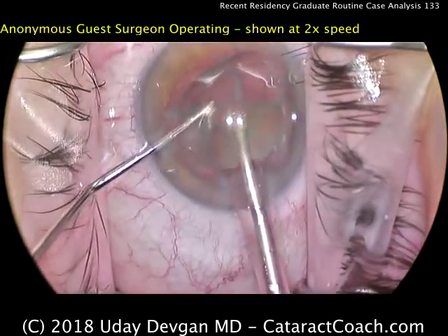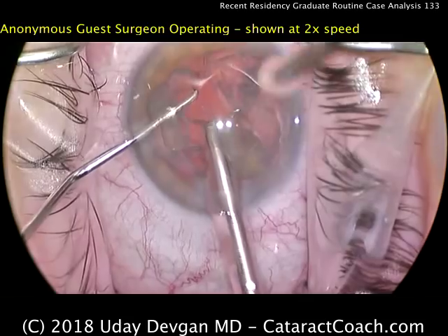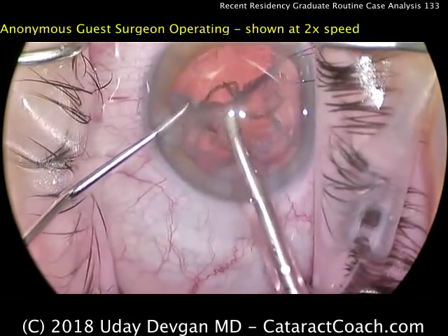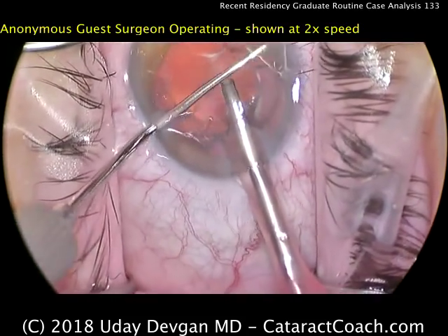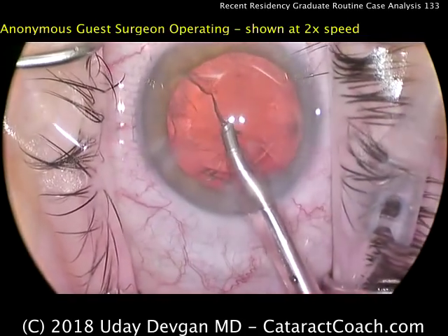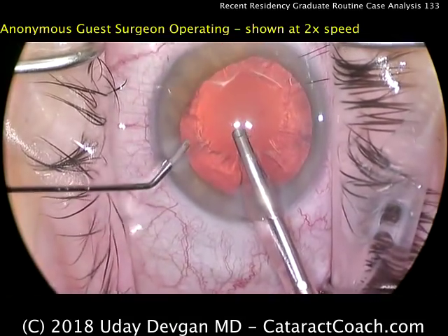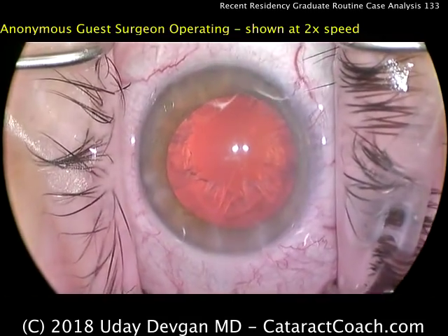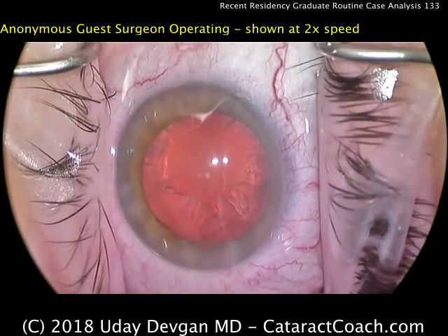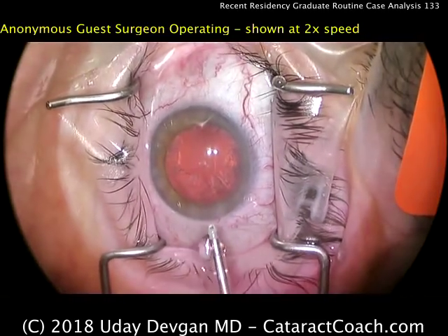This is a talented young doctor. The eye is being kept in primary position pretty much. I do also like the draping — the lashes are out of the way, that looks great. There's the remainder of the lens material, and there's the epinuclear shell. That comes out quite nicely. I like to keep the blunt end of the chopper just to protect the posterior capsule. I'm very impressed that this young doctor could learn phaco chop in just a few hundred cases — that's fantastic.